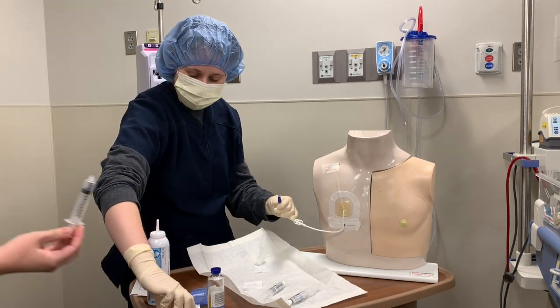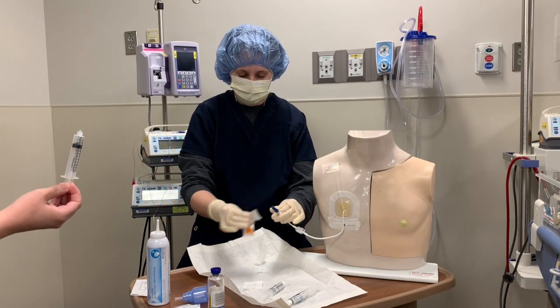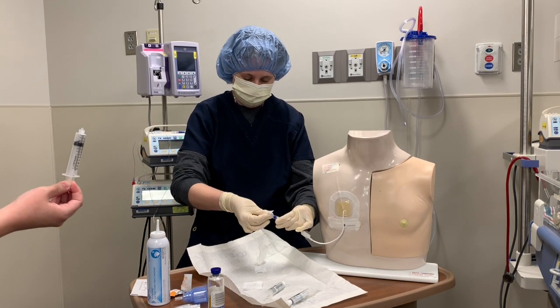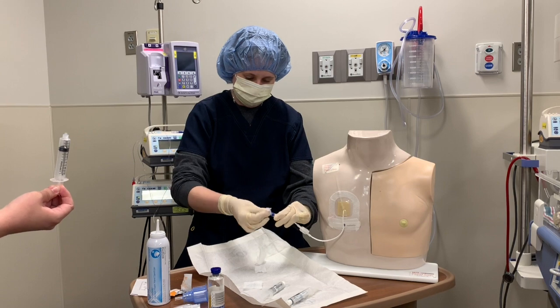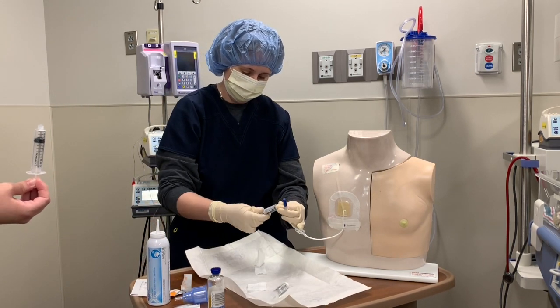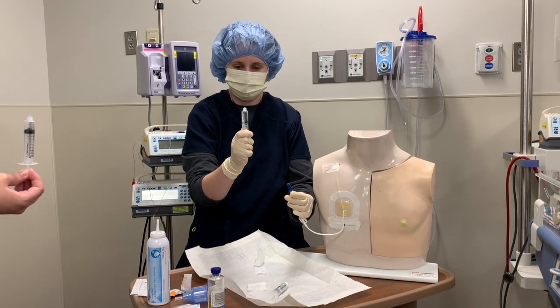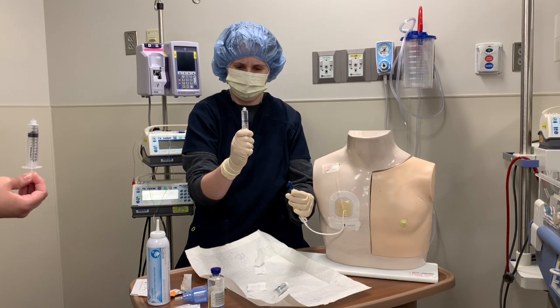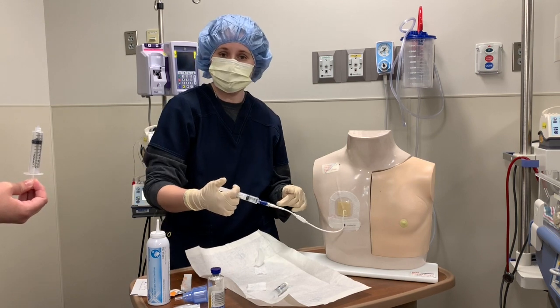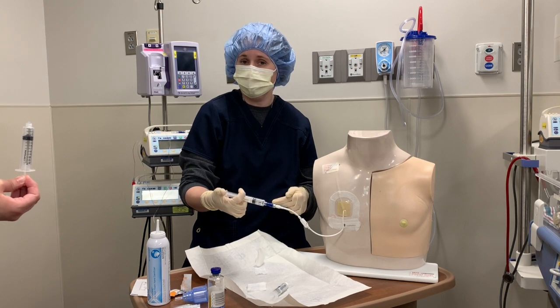Now this is no longer sterile — I'm just clean. If I thought for any reason this touched anything, before I flush, I can always clean again on the blue clave and let it dry. Then I'm going to do a pulsatile flush. You can flush according to the pediatric normal saline flush table, or if you're heparinizing, you can follow the heparin flush table.